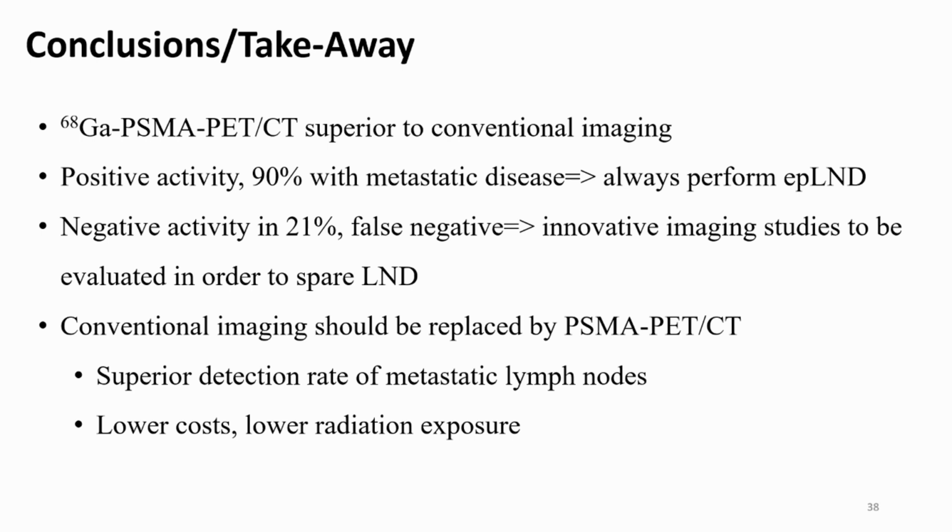the lymph node dissection. And from this study, the authors make the conclusion that conventional imaging should be replaced by PSMA PET CT. There's superior detection rate of metastatic lymph nodes, and maybe in Europe, not in the US yet, but lower costs, still quite high in the US, potentially depending on insurance approval, but lower radiation exposure as well.